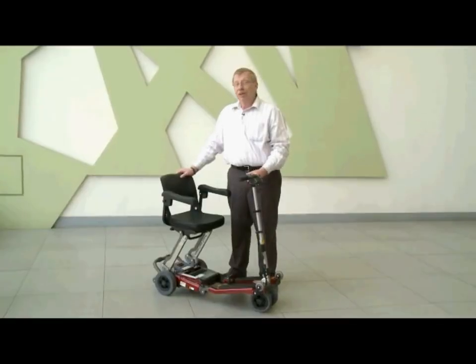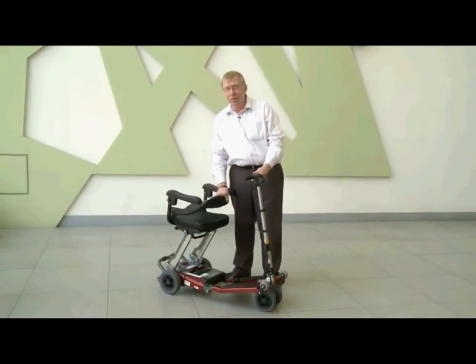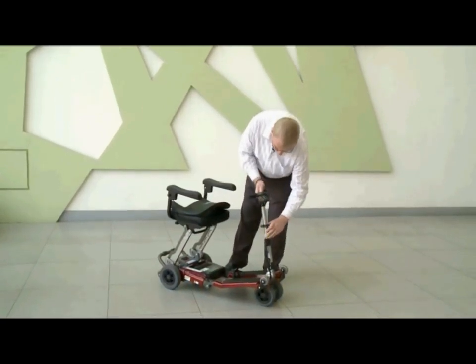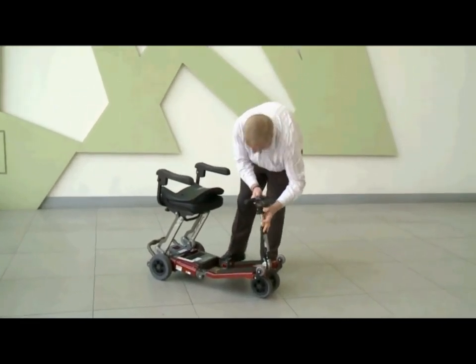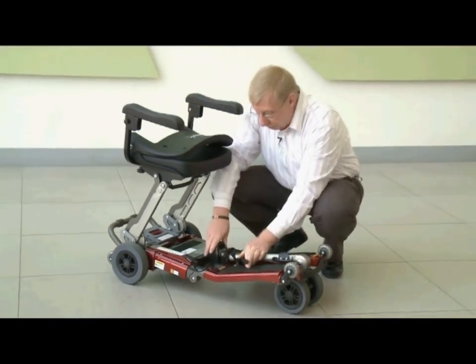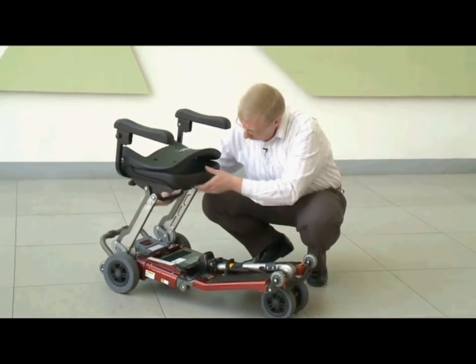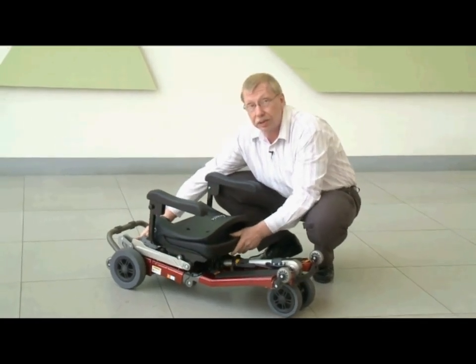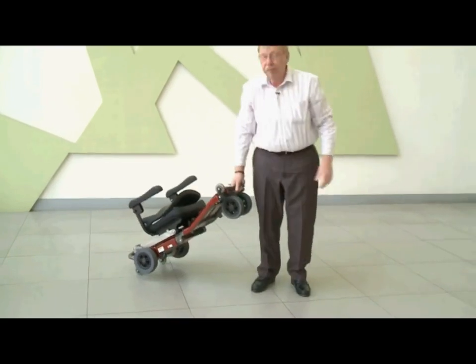There are two ways that you can fold this and bring it with you. First, put the seat back down and lower the handlebars, re-clamp them, open up the bottom clamp and lower the handlebars into place. Next, re-lock the clamp. Now lower the seat into its stowed position and make sure that it's locked. That's it, you're ready to go.